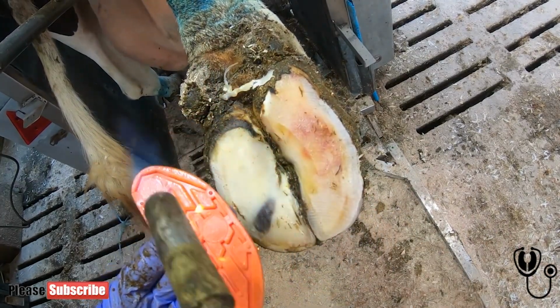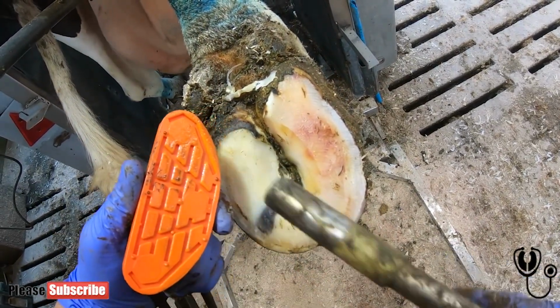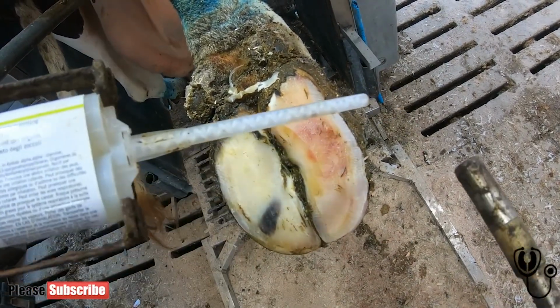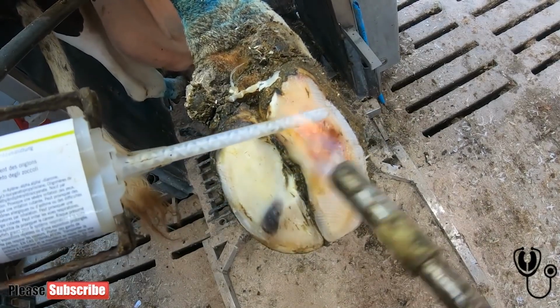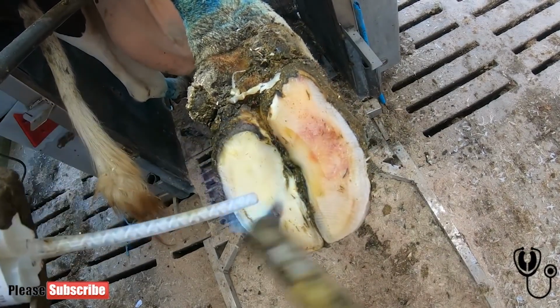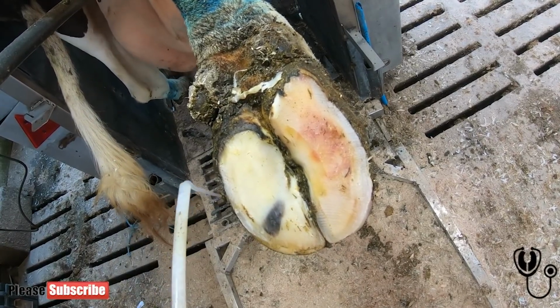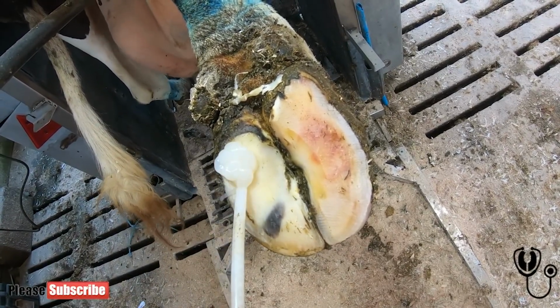We've dried and heated the block a bit. We've dried and heated the foot a little bit. And now we're going to heat the nozzle. So instead of heating the glue, I heat the nozzle because the nozzle will heat the glue as it comes through.